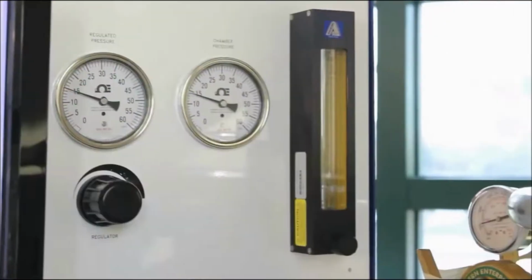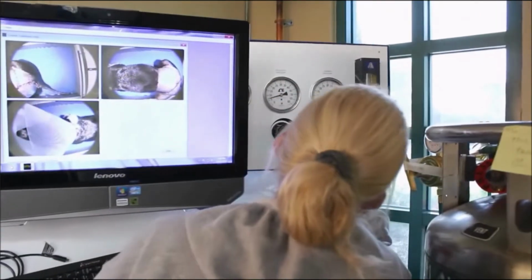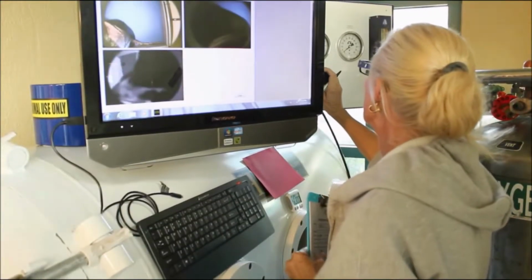Hyperbaric oxygen therapy is actually very safe. It is a frequent concern from the clients and referring vets because it is liquid oxygen and we are putting it under pressure in this big chamber. However, following all the protocols and of course the adequate and proper full training, there's absolutely minimal risk for any complications.